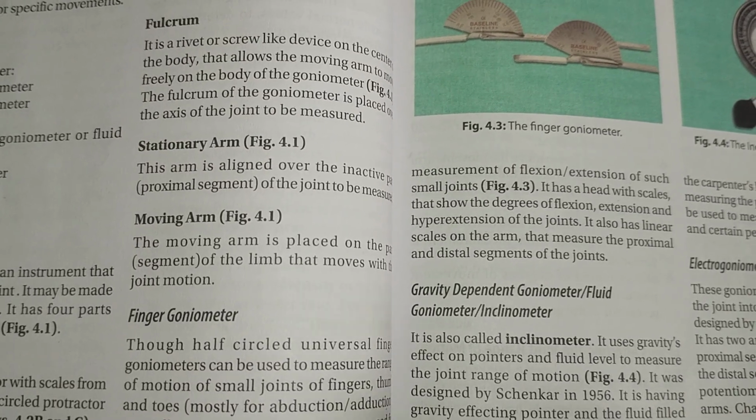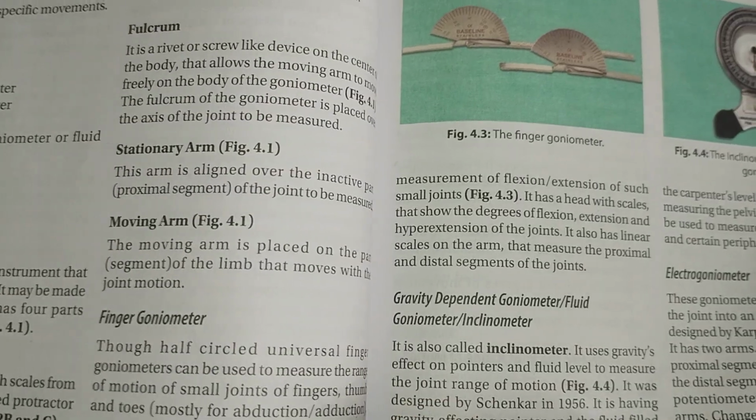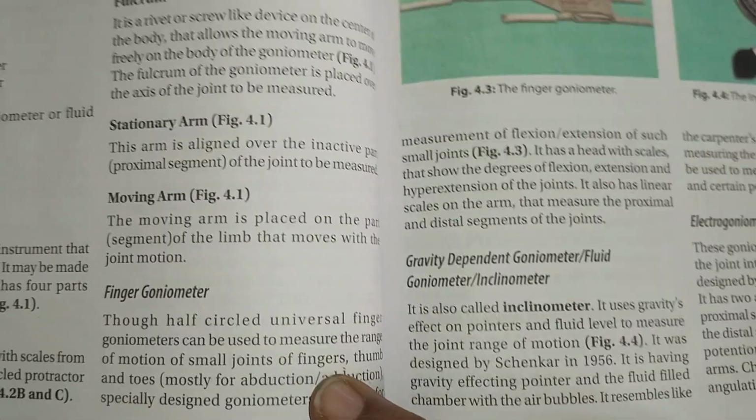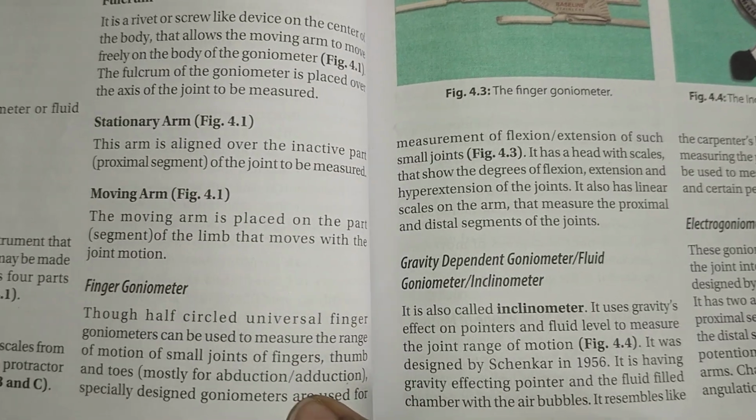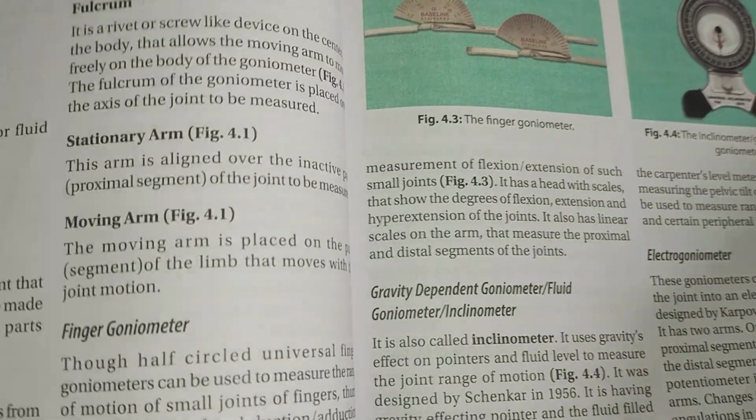Though half circled universal goniometer, finger goniometers can be used to measure the small joints, mostly for abduction, adduction, and specially designed for the flexion and extension of such small joints.